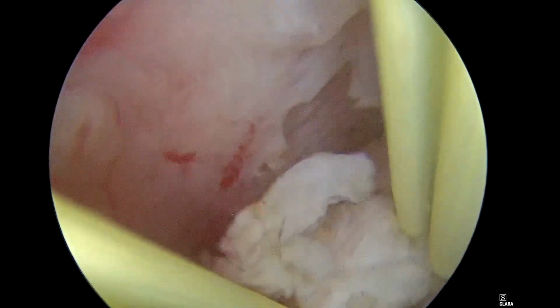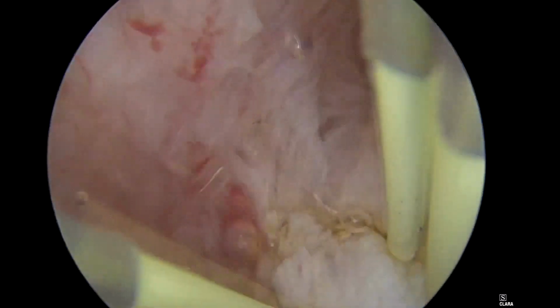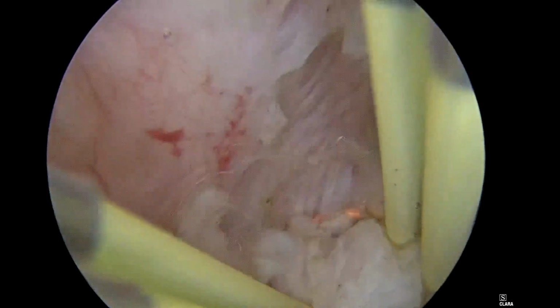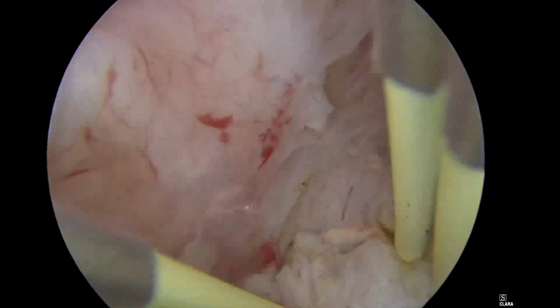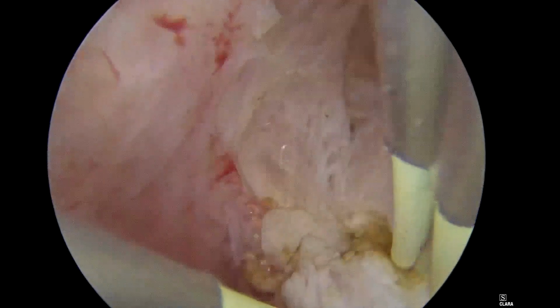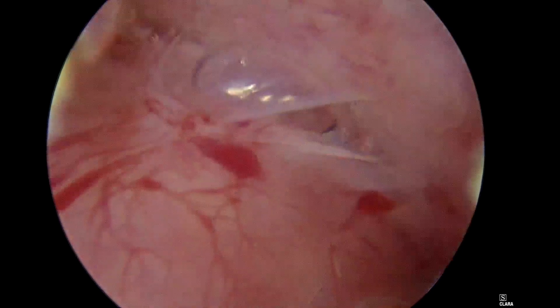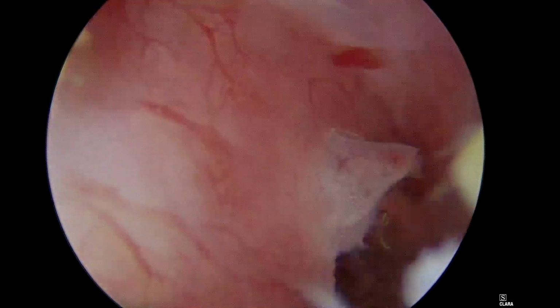Air embolism is known as the catastrophic fatal complication happening when a bolus of gas or air gets into vascular channels and into the pulmonary tree, obstructing the exchange of carbon dioxide and oxygen. This leads to hypercapnia and catastrophic complications. I will explain what happened. Here, in slow motion, you can see the gas bubbles getting swept and sucked up into the cavity of the myoma. This is aggravated because of the position of the myoma on the anterior wall.